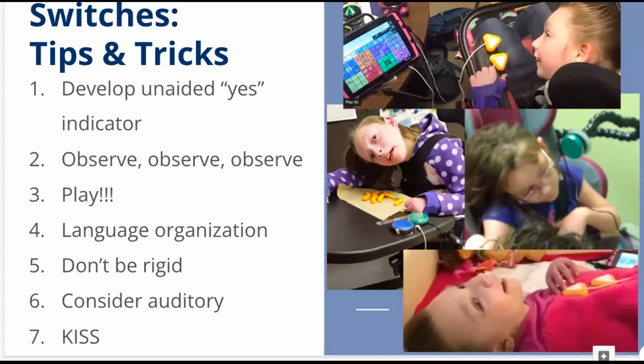When we choose switches that are wireless, we have a lot less cord management. But on the other side, if they are wireless, there is some level of Bluetooth management or dongle management, however it's synced to the computer or communication device. And so then there's a level of technology sophistication that the user support team or the user themselves needs to have to be able to troubleshoot that.